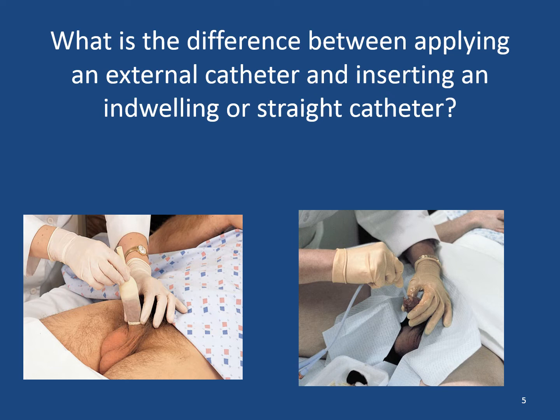Straight catheters are used for immediate drainage of the bladder, then the catheter is removed. It's used to relieve retention, which may have specific orders for use in any urinary catheter if the output is greater than a certain amount. It's used to empty the bladder intermittently. We would want to make sure that we're checking our agency policy for this. There is a maximum amount of urine to be drained at one time.